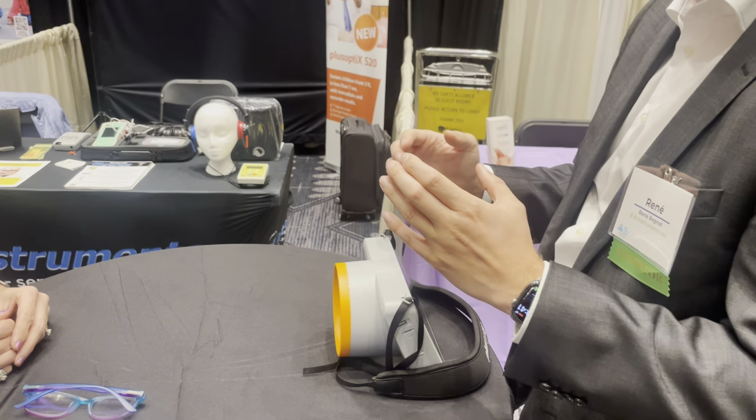Behind that smiley face, behind that nose, is our camera. Around the nose, we have the LED lights. You don't see them too much, and you don't want to see them too much because, again, if there are LED lights, children might look at the corners of the lights instead of the smiley face. On the other side, yep. You want them to focus on the nose. If they can talk, I would always tell them look at the nose because this is where the camera is. If they're babies, they will just naturally look at that face.